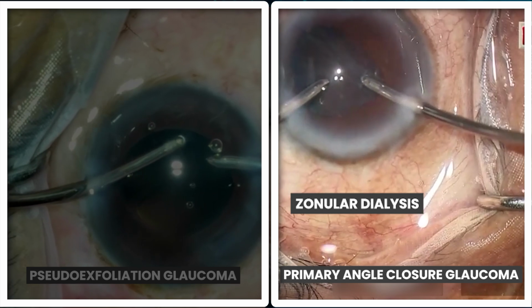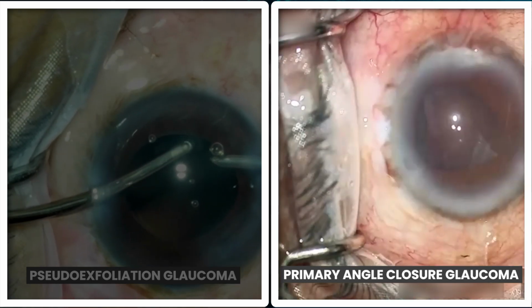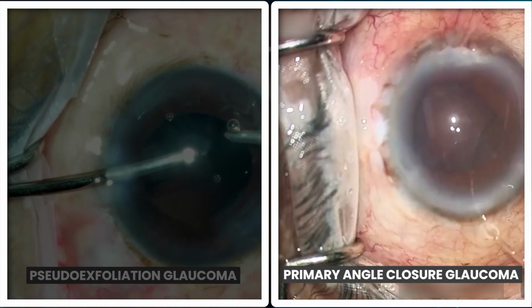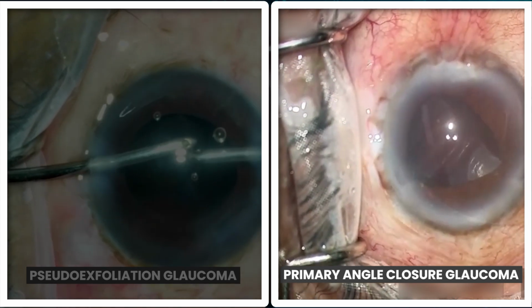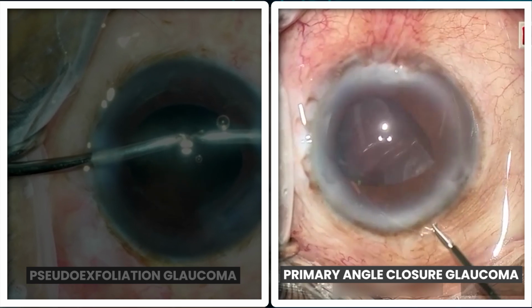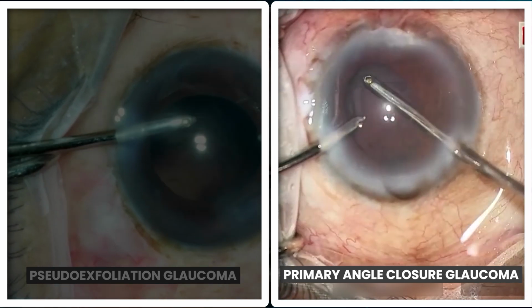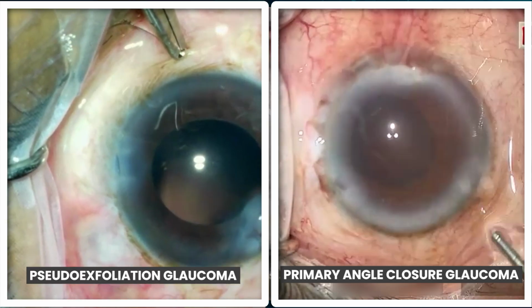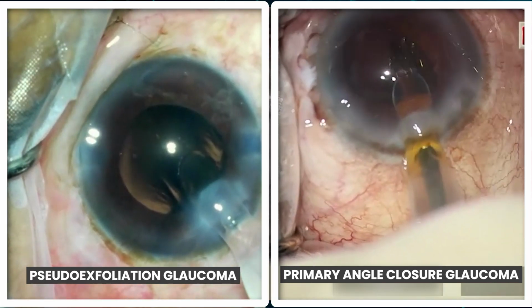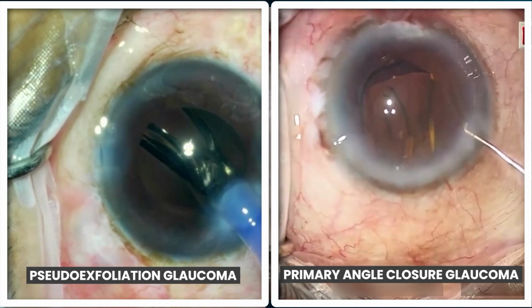Complications such as loss of posterior capsular support are also associated with loss of IOP control post-op. Retained cortical matter and viscoelastics have been attributed to bleb failure. And last but not the least, the IOL must be placed in the bag.